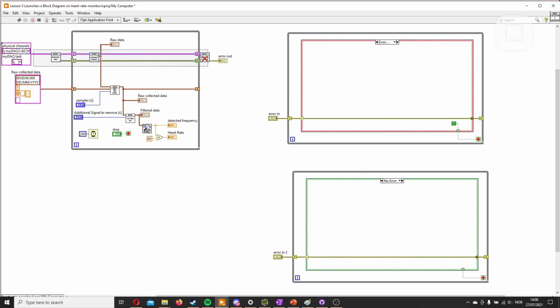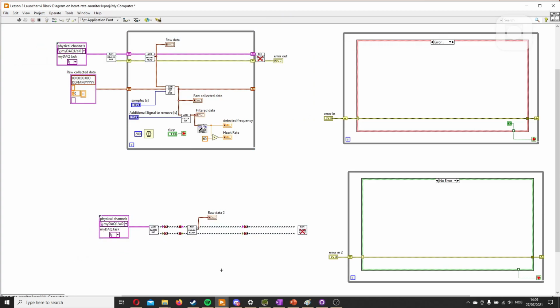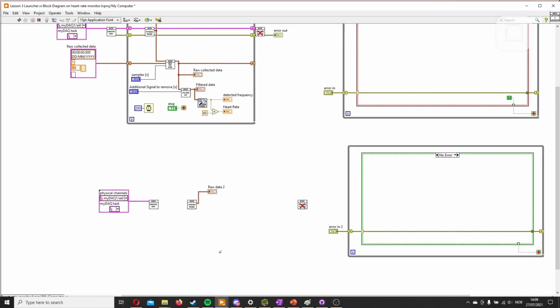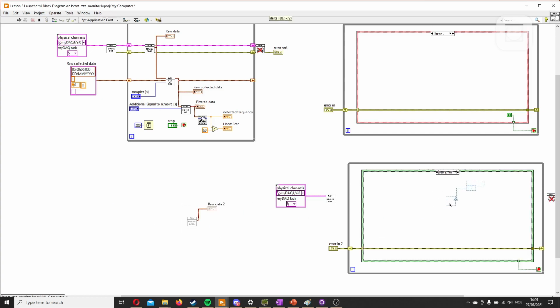What we'll do is just copy this part. Control C, Control V, and just have it here. And then I'll press Control B to remove the error. And just like above, we want this one on the outside, we want this at the end, and we want this in the middle.